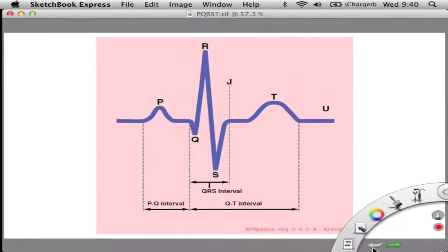Next, you have the nice big tall peaked R wave there. It's the positive. The QRS is often referred to as the QRS complex because they happen in such fast succession that they just call it one complex for the most part. They'll refer to it as a QRS complex. But there are individual parts to it. So the R wave is the positive waveform after the Q wave. So you can see, right, isoelectric line again, it's this positive wave that's here. Okay?